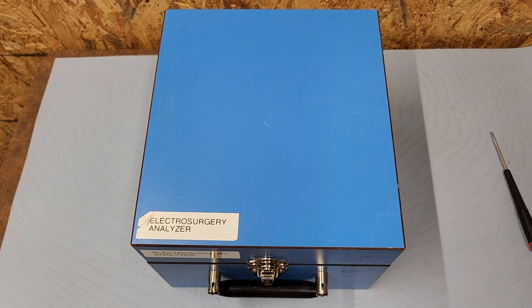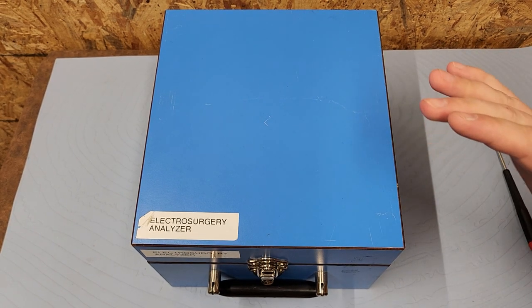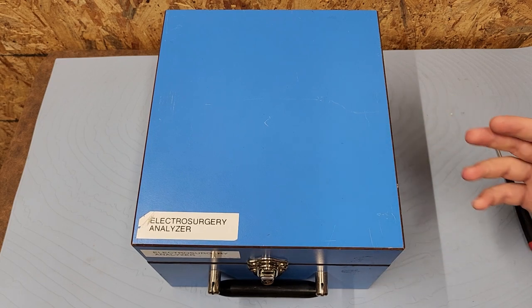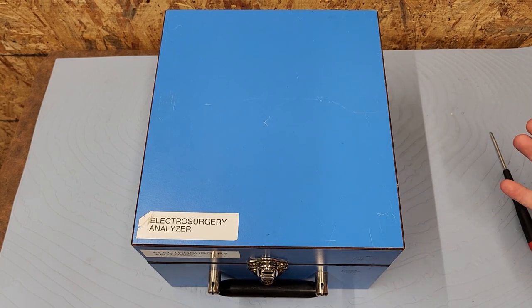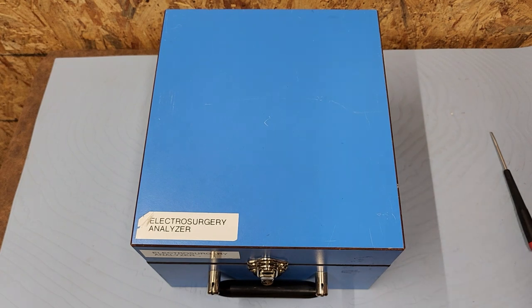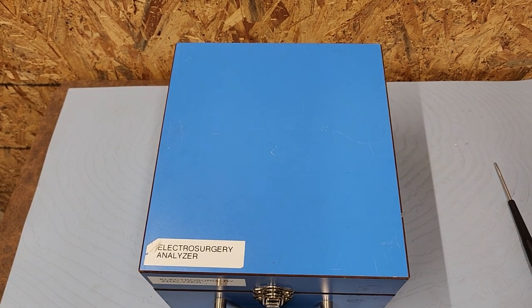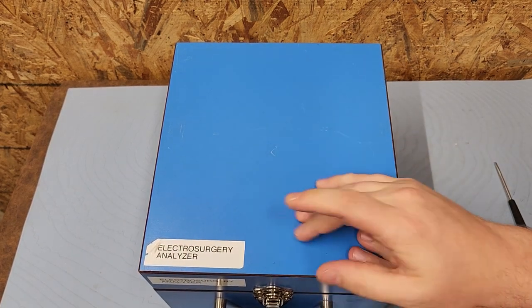Hey everyone, welcome back to Better Biomed. I am so privileged at this very moment because I stumbled on a vast trove of vintage equipment and people are allowing me to go forth and make videos based on where we've gone as a career field. That takes me all the way back to the very beginning — around the 1970s-1980s is when some of this equipment herald from. Here we go — this right here, as you can guess from the label, is an electrosurgery analyzer.